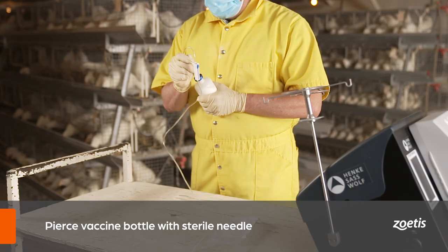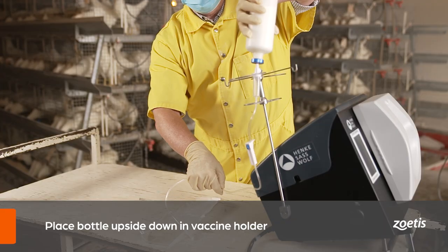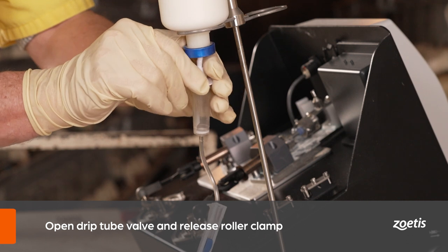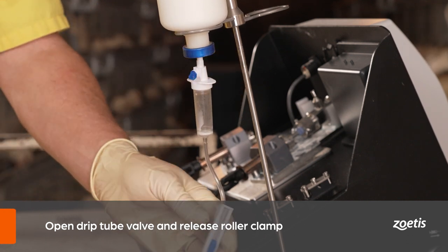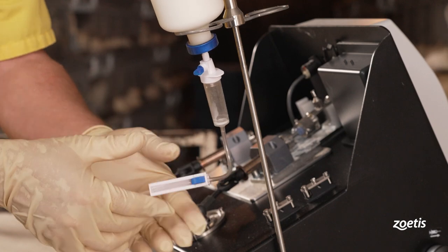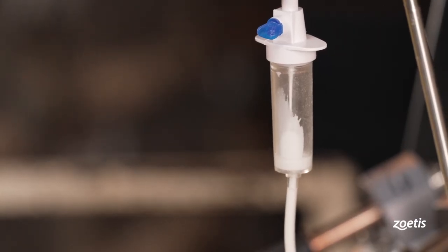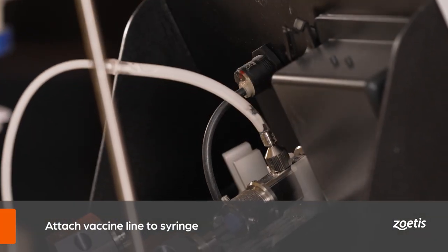When setting up the vaccine, first pierce the top of the vaccine with a sterile needle, then insert the drip tube through the same hole. Place the bottle upside down in the vaccine holder. Once the bottle is in the proper position, open the valve on the drip tube and release the roller clamp so the vaccine begins flowing into the drip chamber.